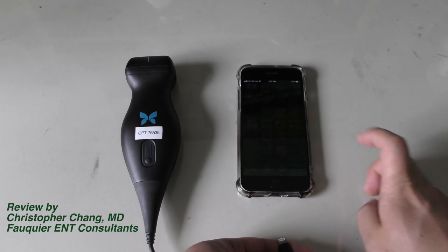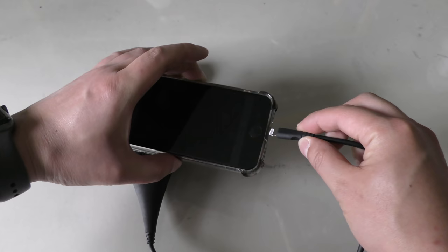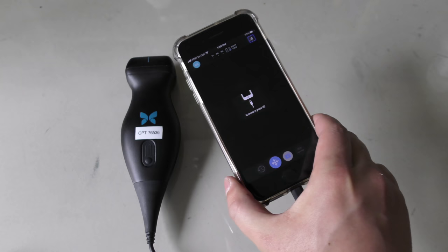You simply plug it into your smartphone — in this case an iPhone — and open the Butterfly IQ app, which can be downloaded for free. Once the app is opened, you are ready to start performing an ultrasound exam as per routine with a dab of jelly.